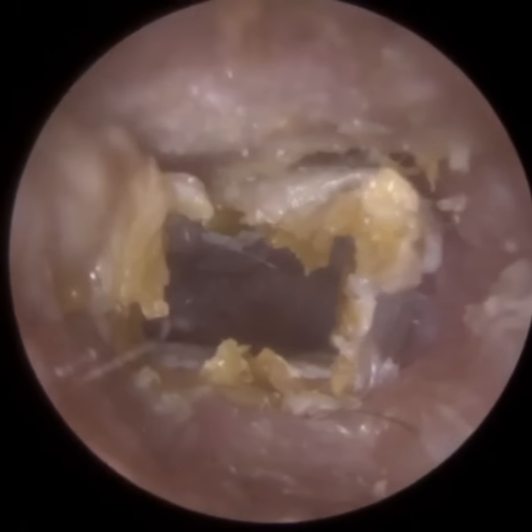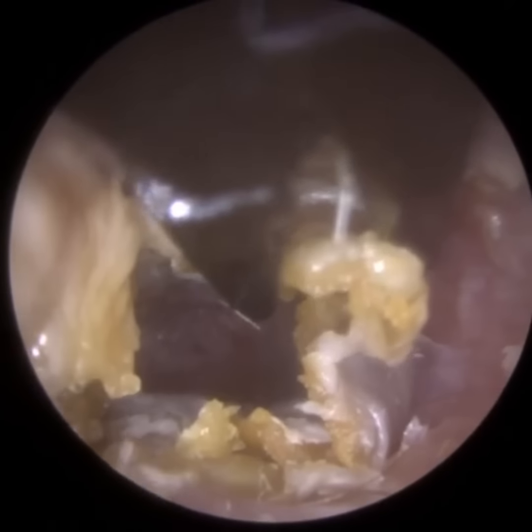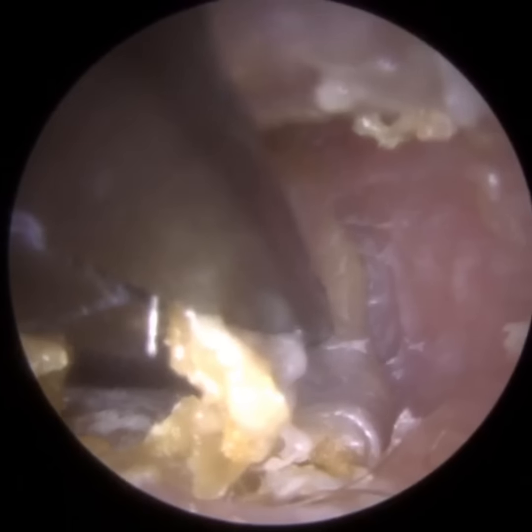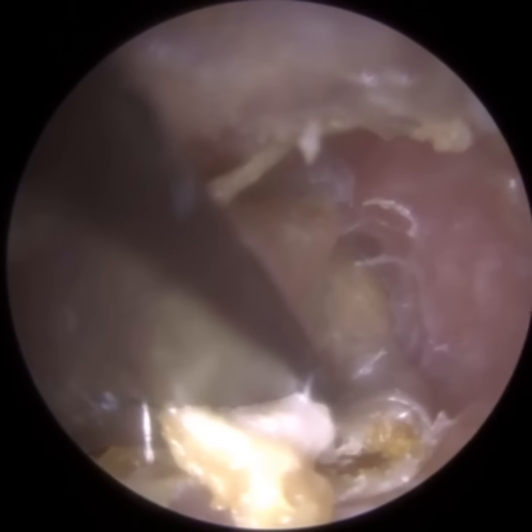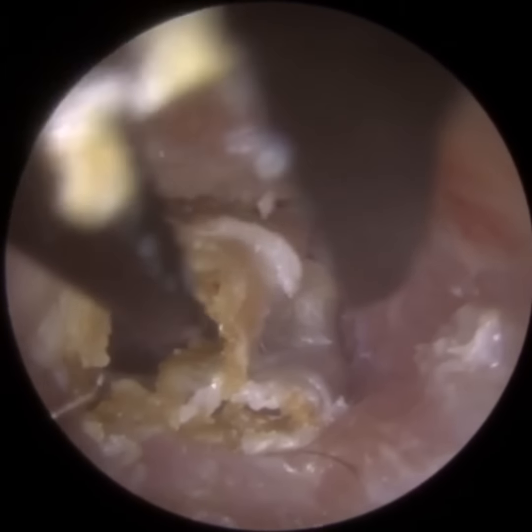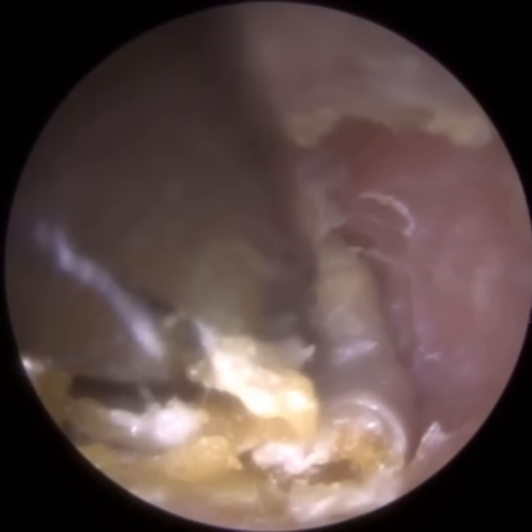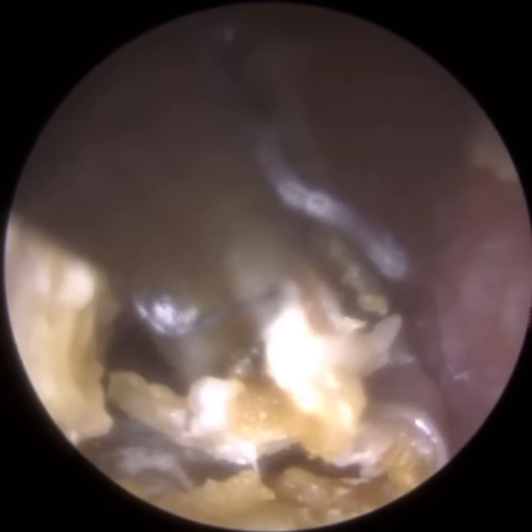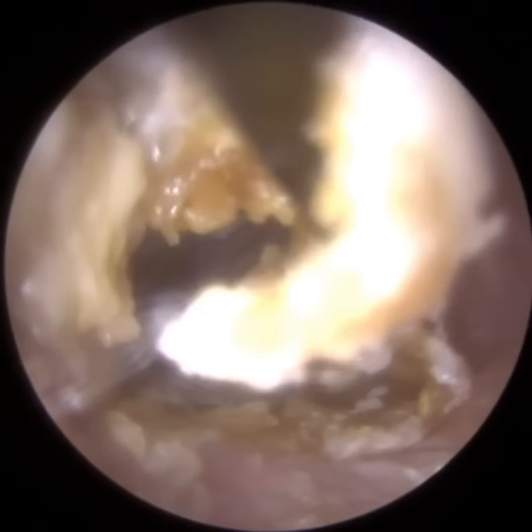So we're going into the ear, it's widened, there's the expansion. You've probably got a really good view of that, where the ear canal's widened, and then it's narrowed again, it's swollen here. So I'm just using forceps, just trying to release the skin, trying to peel it off the back part of the ear canal. I'm being careful not to clamp, that's the word, the forceps, because I don't want to cut through the skin. I just want to have a bit of purchase, a bit of grip, so I'm being quite gentle when I'm closing and clasping the forceps. I'm doing it really slowly, just trying to wriggle, loosen it.